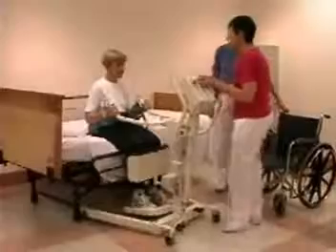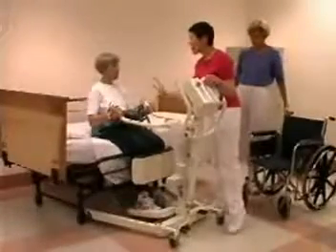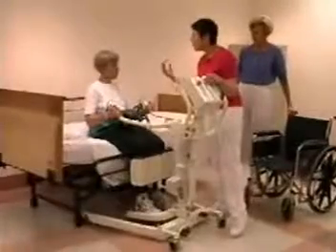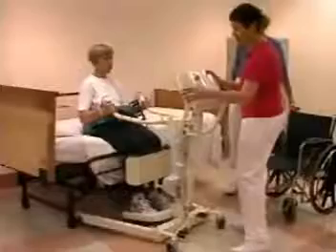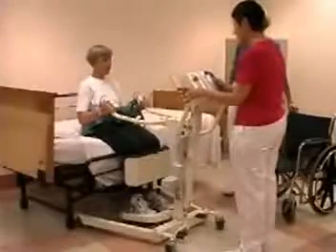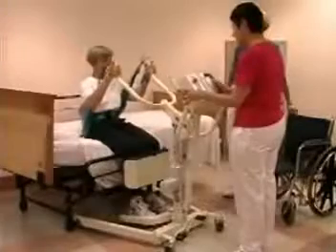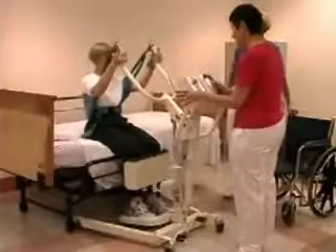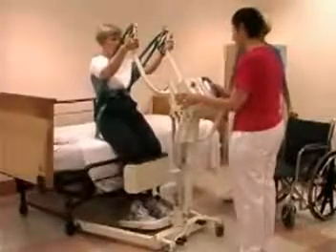Okay. Mrs. Johnson, I'd like you to lean back slightly while we do the lift. That's perfect. And that's going to keep you right in the spot where you should be in the sling. Okay.